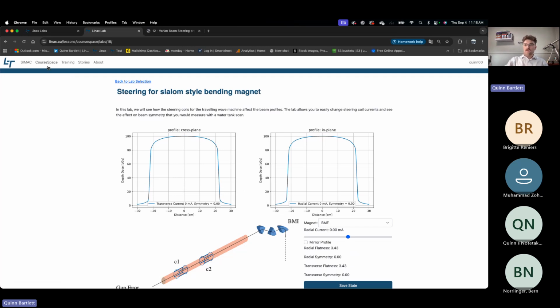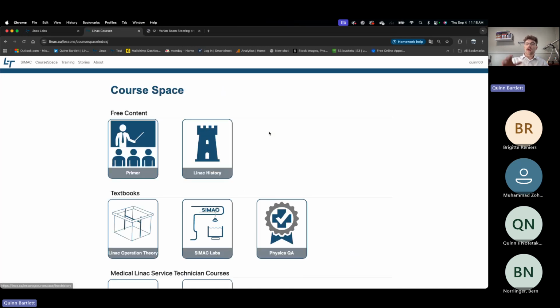So then we have the steering ones in the labs, and then the final bit. I started at the simulator, and now I've gone all the way back to the labs. But if you really did want the introduction, the suggested way that we would say would be to start with the lab, because it gives you an introduction without having to understand all the nuance of the simulator.